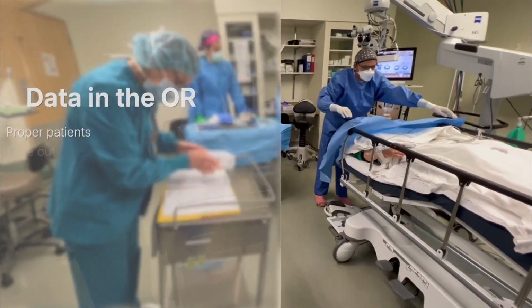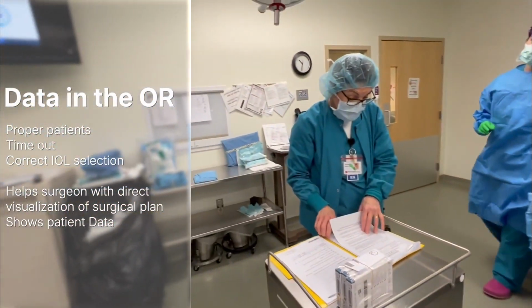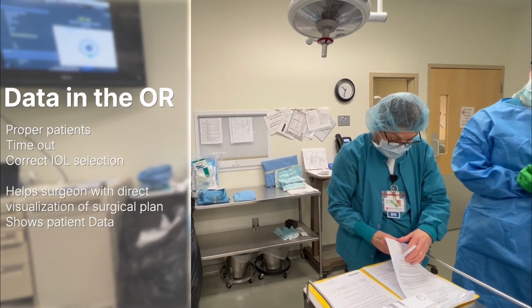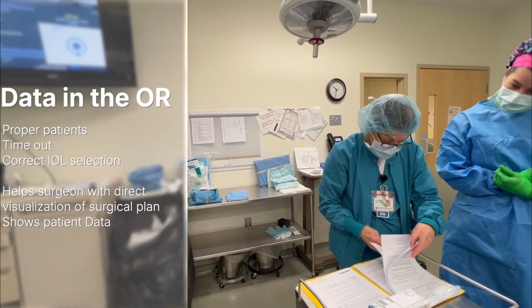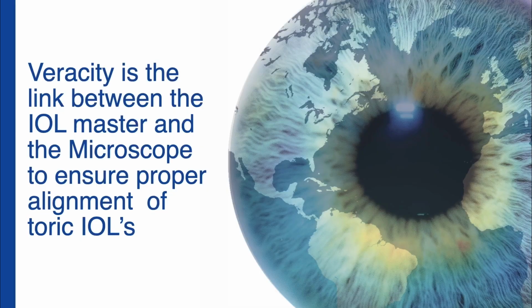We even use it for doing our surgical timeout. And here's that video you're watching, seeing the scrub nurse and the tech look, seeing that there's the proper patient. They're doing the timeout, showing that the correct IOL is there. And it's even going to help during the surgery with direct visualization of that patient and carrying out the surgical plan.